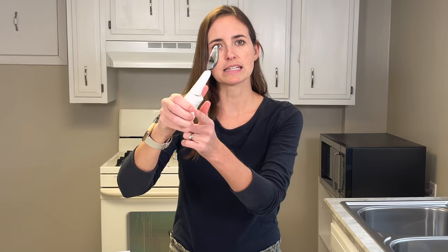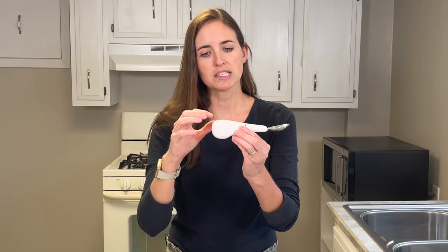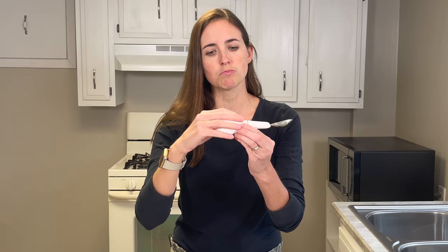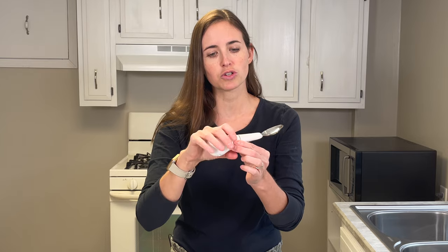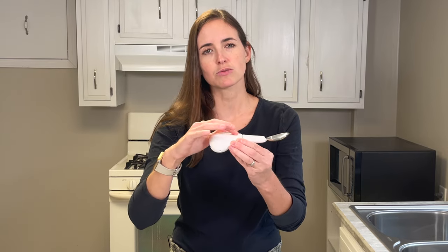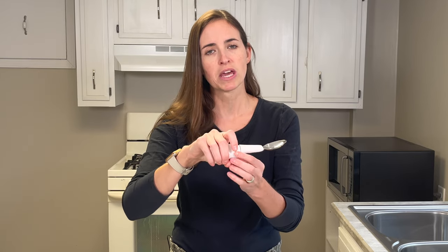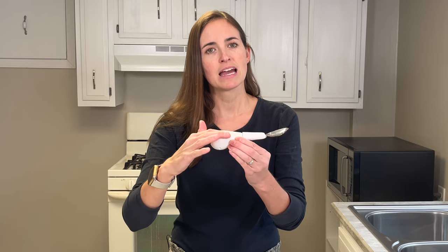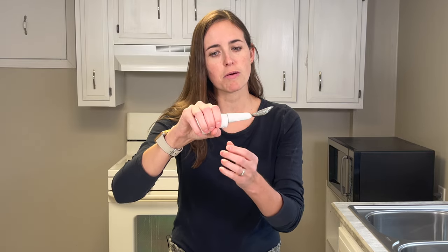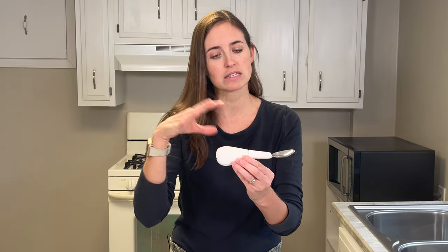You can also hold it where it has the nice thumb indent at the bottom. One critique I had is that this is extremely smooth, and if you have grip issues, it might be difficult to hold on to. You could add some grippy tape or even a small amount of Dycem — a double-sided silicone product — on the top or bottom to give it a little more grip. If someone has tremors plus hand weakness, that could be a real problem.